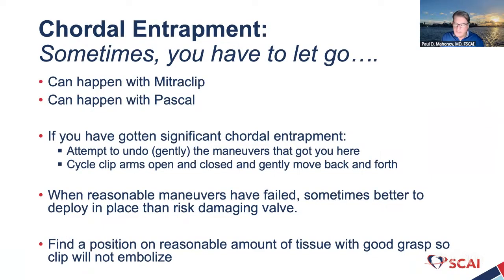So you didn't do what you were supposed to do, or things got a little hairy and you've got chordal entrapment. Sometimes you have to let go. It can happen with MitraClip. It can happen with Pascal. It's been reported and it's been seen. So if you've gotten significant chordal entrapment, first attempt to undo gently the maneuvers that got you there. You know how you got there. Try to go in reverse. Use your muscle memory to try to get you out of it. Cycle the clip arms open and close and gently move back and forth without excessive tension.